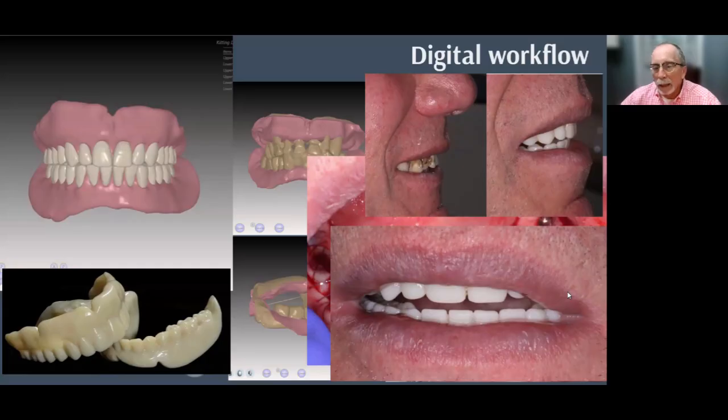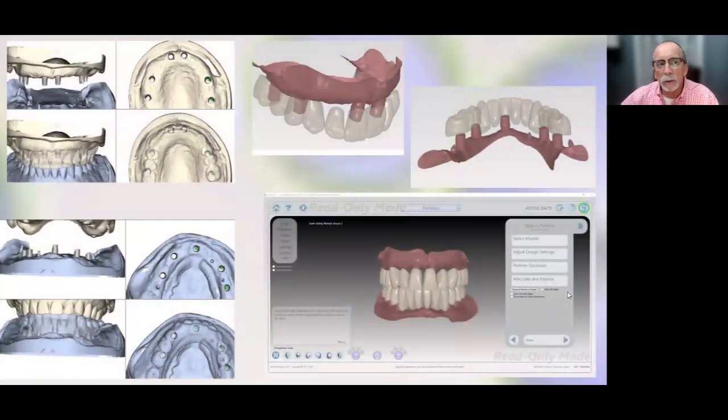And so delivery, and so what you're going to do is just obviously healing, but also this is where we can dial in the bite. This is not his bite. We didn't get a good picture of the facial look of the bite, but the bite was off a little bit. So we had to grind and add a little bit to these things to get his bite dialed in. Get his midline correct. And that's what healing and treatment's about. That's why we call it prototyping, right?